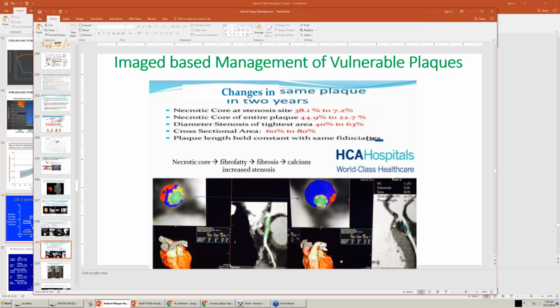So we can just look at that plaque and see, look, there's less necrotic core, there's less red stuff, there is a smaller lumen, and there's more fibrosis, which is the blue stuff. This is all color-coded. And of course the lumen is the green where we color-coded the contrast. Looking at calcium, we don't have calcium measured here, and this yellow is not calcium.